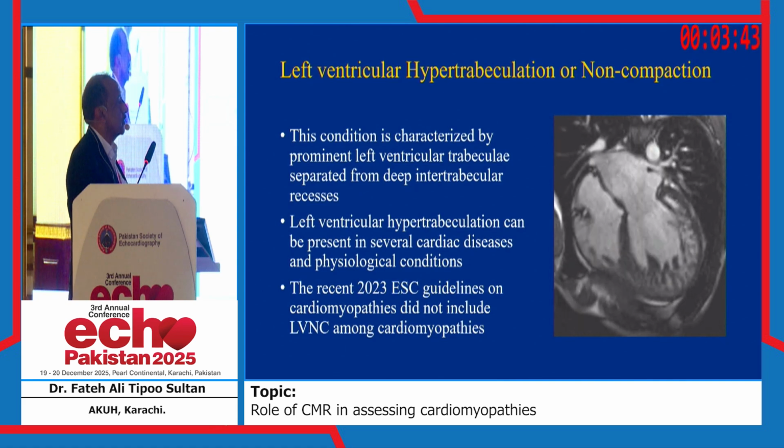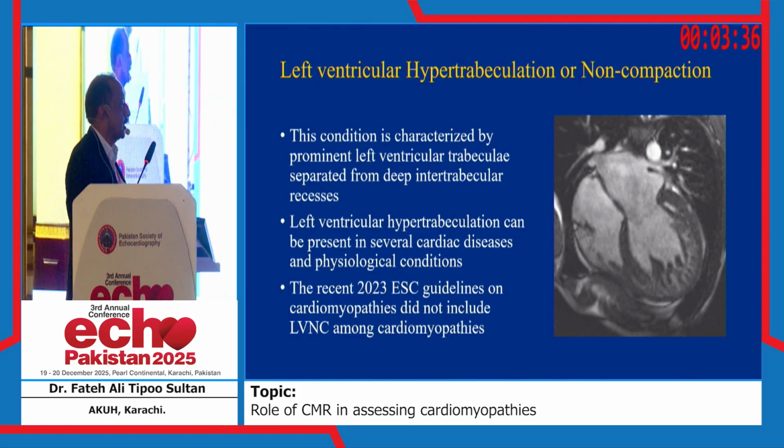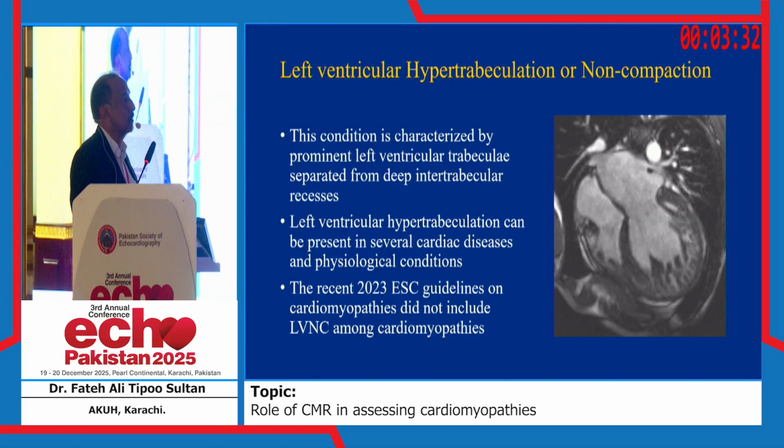Left ventricular hypertrabeculation or non-compaction, nowadays ESC guidelines say that it is not a cardiomyopathy and it may occur in a number of conditions, but hypertrabeculation you can pick up on CMR very well.